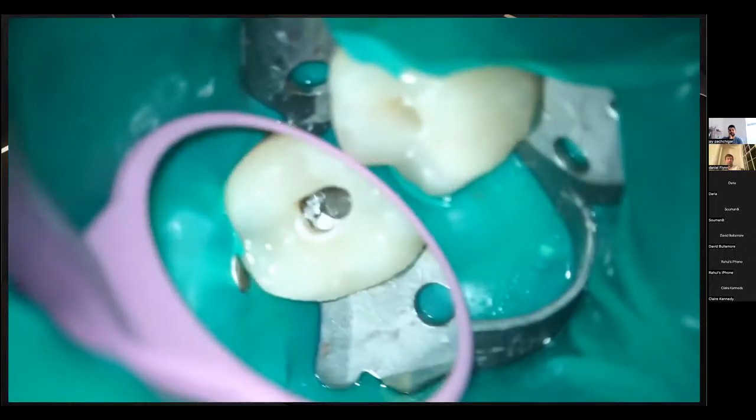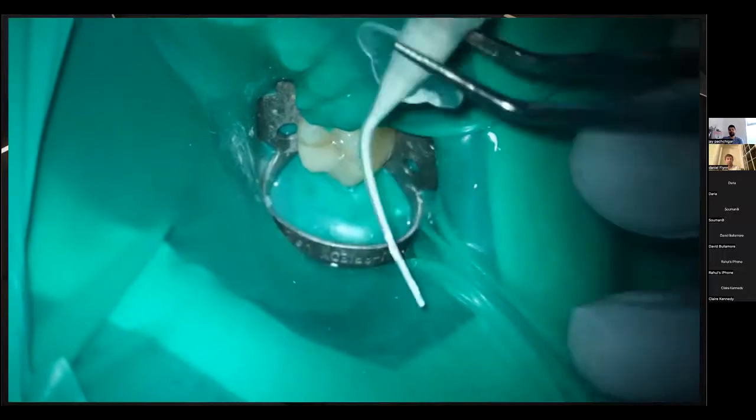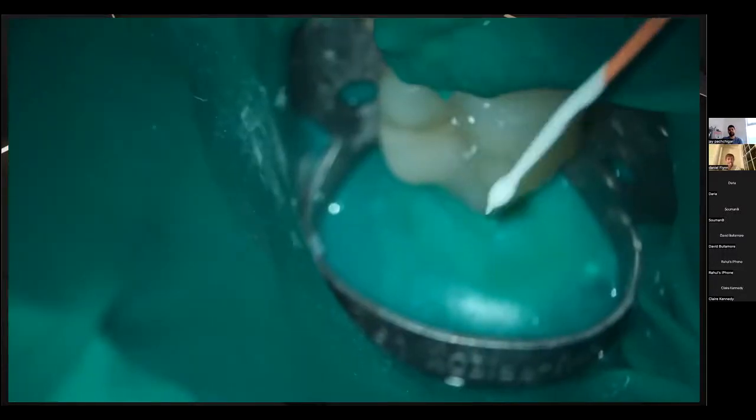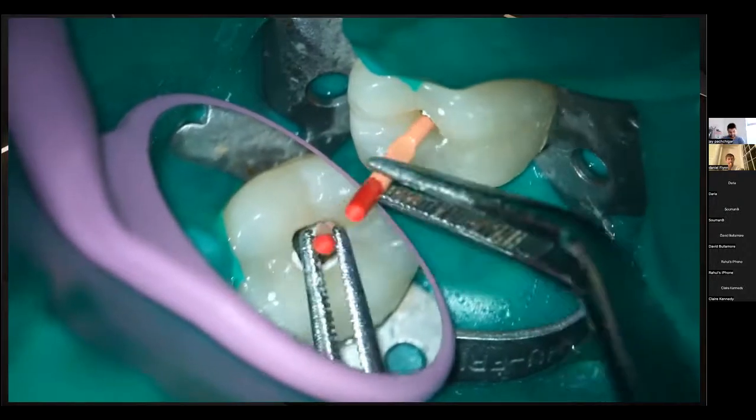So that's into the middle mesial. It's coming out the mesial buccal and the mesial lingual. You do get a decent amount of wastage, but sometimes on these type of cases, I don't really mind because I know that I'm getting a good amount of sealer into these teeth.